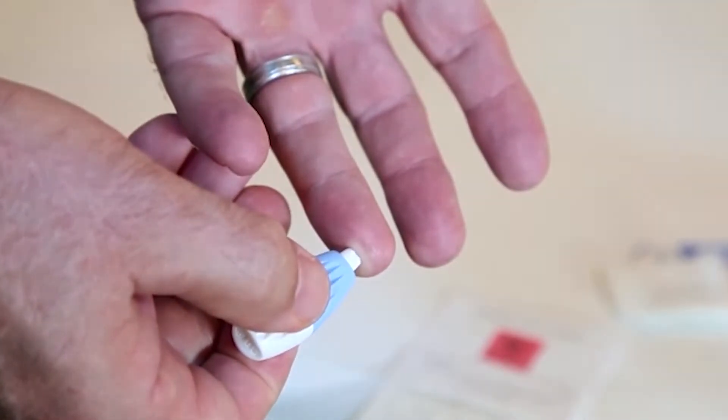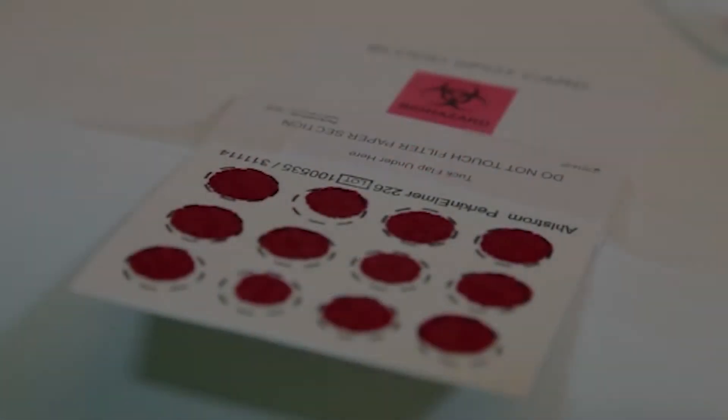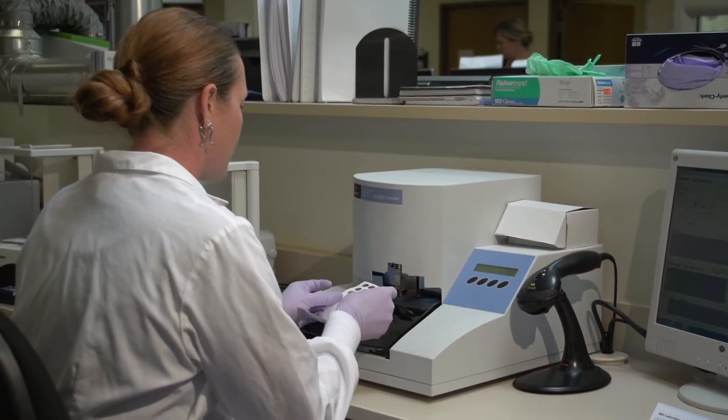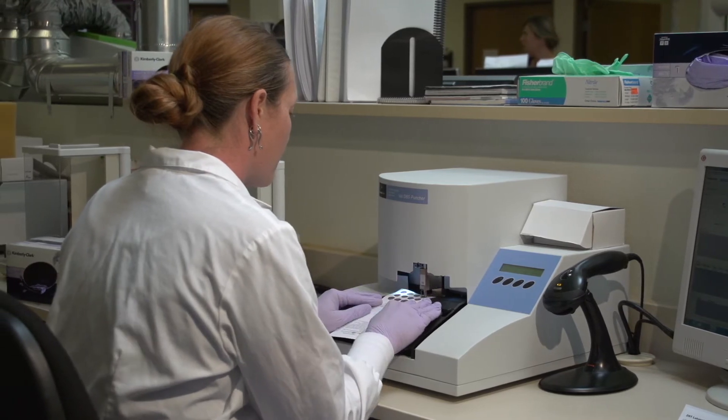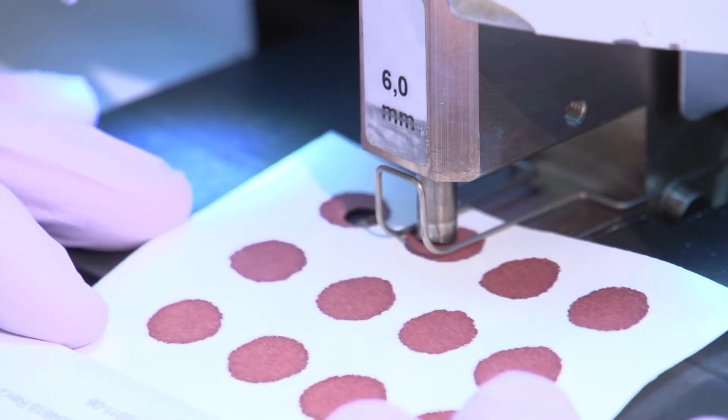Blood spot is a simple nick of the finger and drawing blood from the finger to put it on a filter card. Each drop makes a spot of blood on that filter card — that's what we call it: dried blood spot. We collect it on a filter card and allow it to dry.